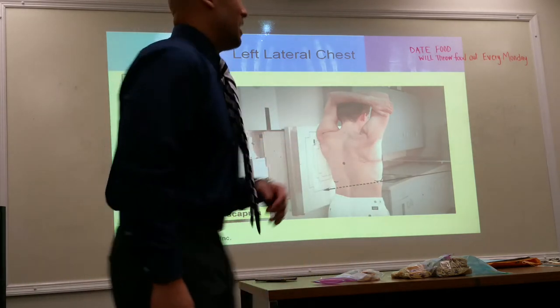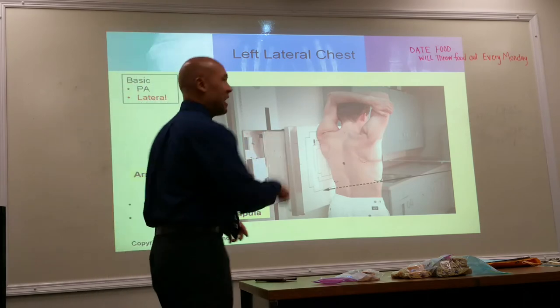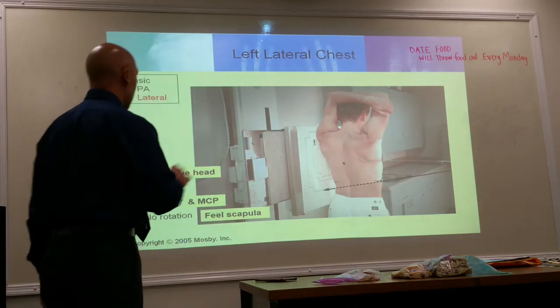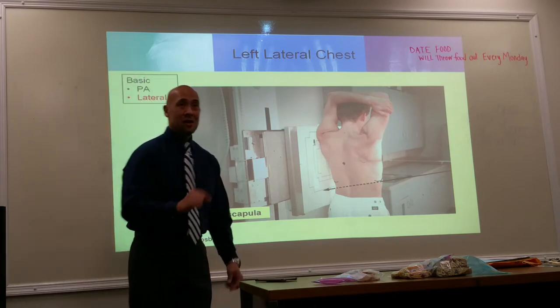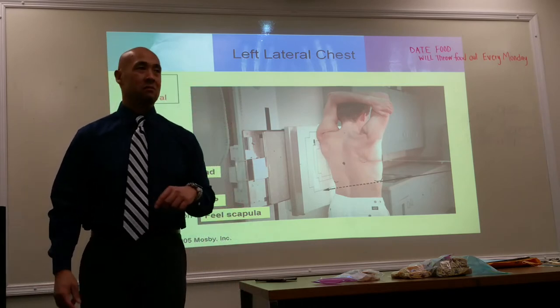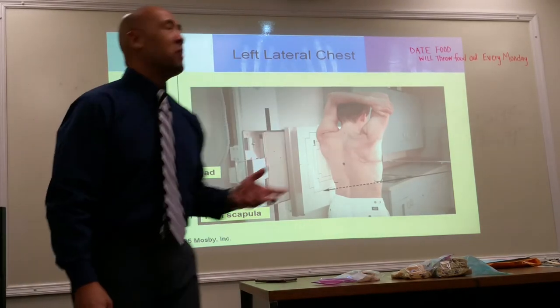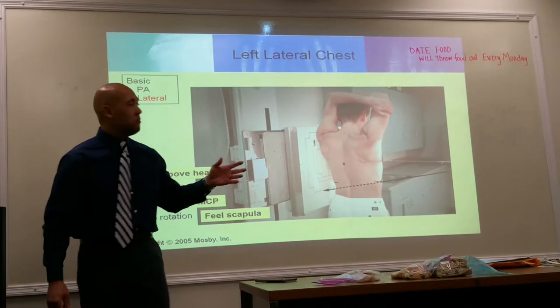Although you were at the level of T7 for your PA, you're going to drop your central ray about a half an inch to an inch. About a half an inch to an inch. Why are we doing that?